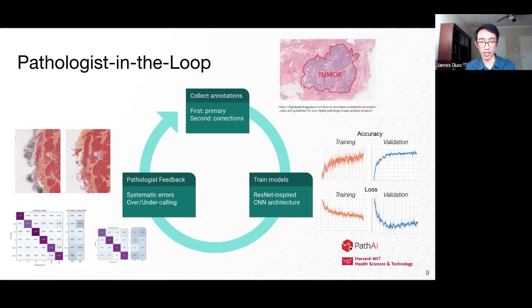But we rely primarily on the pathologists letting us know whether they really believe that the downstream summary statistics, like the number of lymphocytes within 80 microns of the cancer stroma interface, would actually be associated with a real thing.